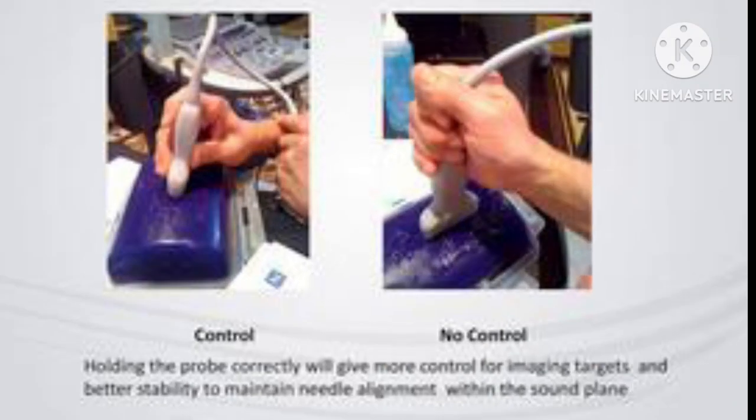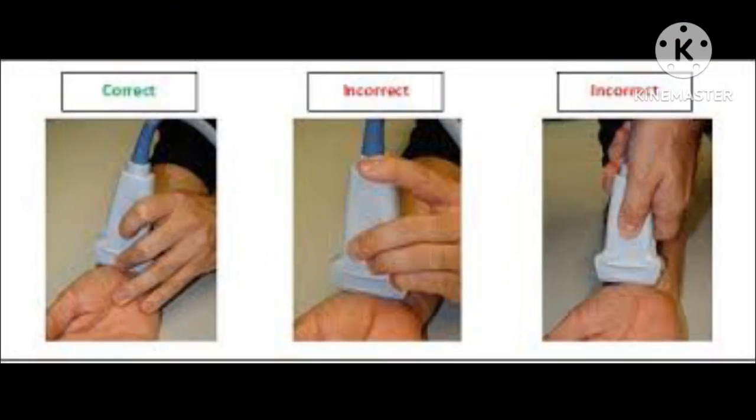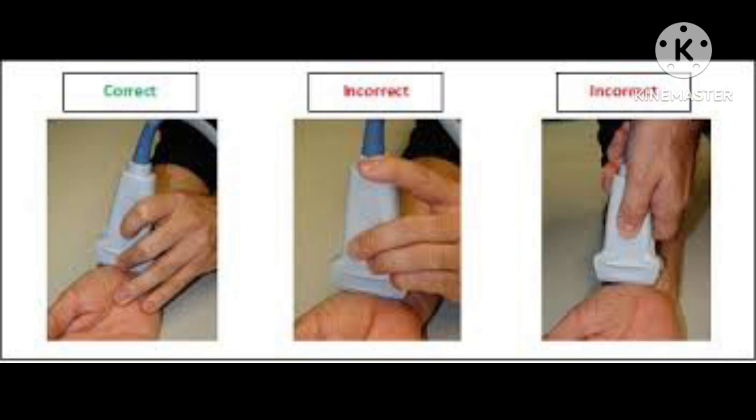Again, the slide showing correct and incorrect method of holding the transducer, where the left side is a correct method, where the transducer is held low and the palm is in contact with the patient's body.